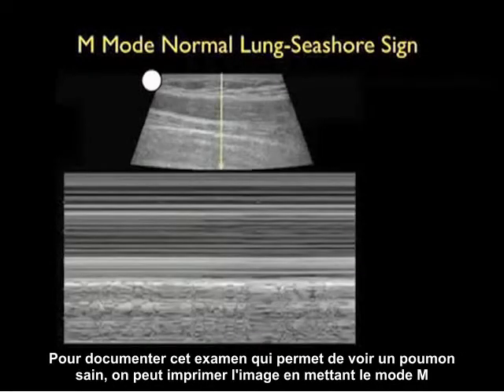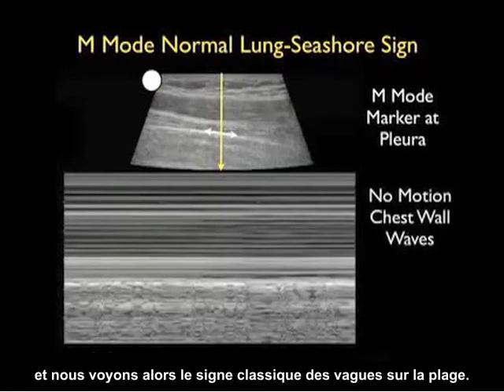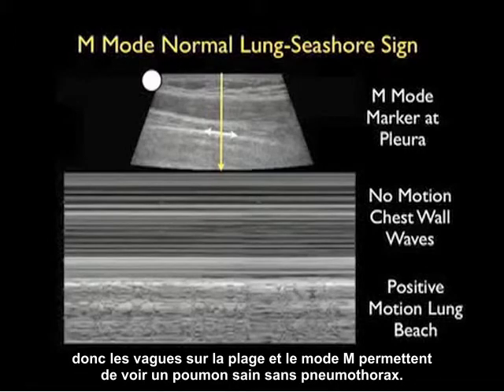A way to document that the lung is up for the chart is to use M-mode, locating the cursor right at the pleura. What we see is the classic seashore sign, or waves on the beach. Anteriorly we see the classic waves — no motion of the chest wall — and below that, deep to the pleura, we see the positive motion of the lung making up the beach. This seashore sign is M-mode documentation that the lung is up and that there's no pneumothorax.